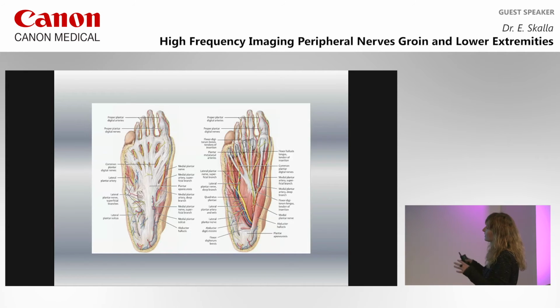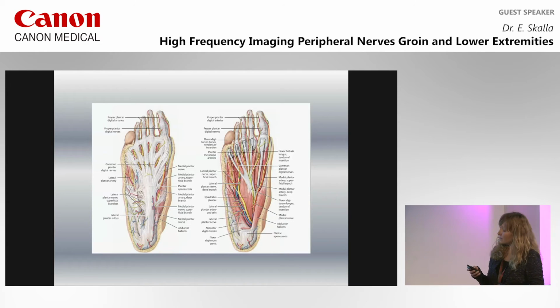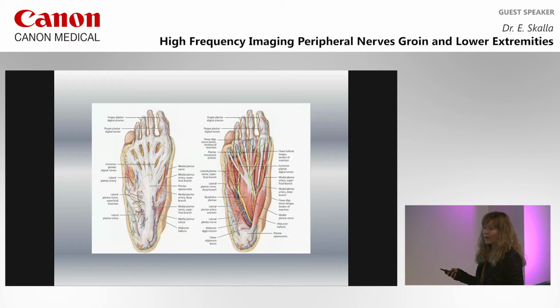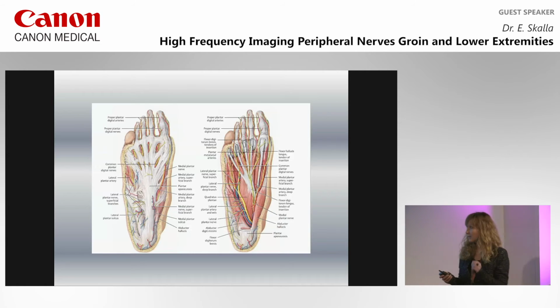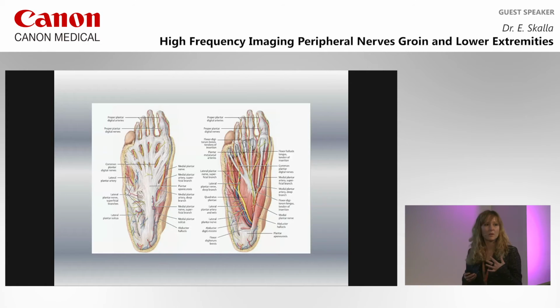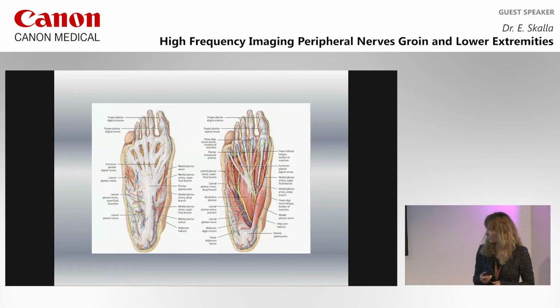They divide into their end branches more distally. And our problem and our external landmark, both, is the plantar aponeurosis. External landmark because it's easy to palpate. A problem because it's very dense and it causes blurring when we do ultrasound there. So it's not very good to see the nerves in the deep of the sole of the foot.